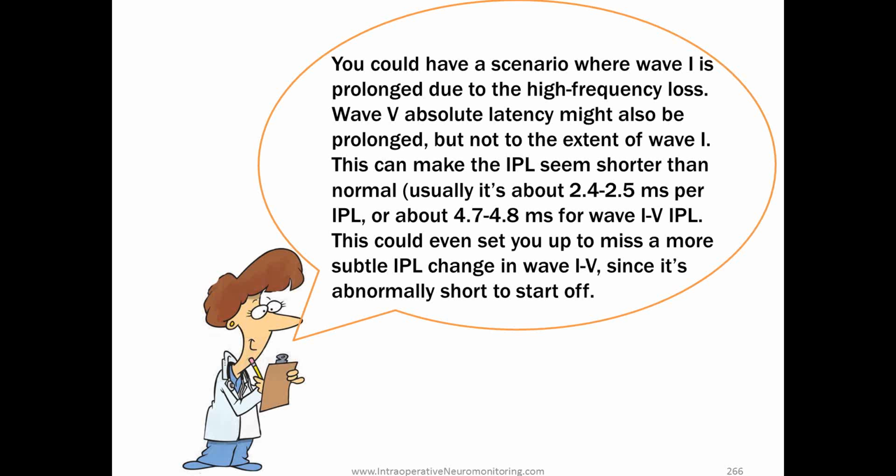So what she's saying is in these high frequency sensorineural losses, wave 1 can be shifted out a little bit, but wave 5 is at its typical latency, which can make interpretation difficult and can shrink those interpeak latencies.